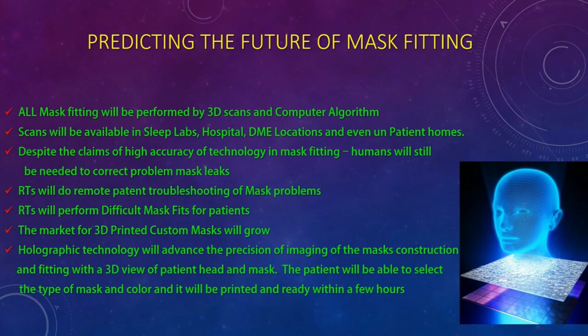High resolution scanning equipment will be available in sleep labs, hospitals, and DME locations. Despite the claims of high accuracy of technology in mask fitting, respiratory therapists will still be needed to correct the problems involving mask leaks. Respiratory therapy will still do troubleshooting of mask fit problems with the patients over the phone remotely.